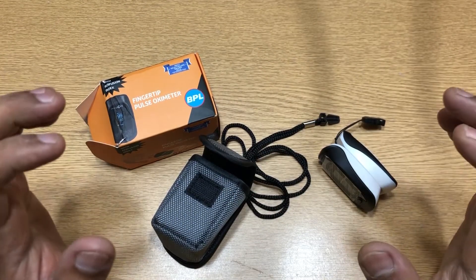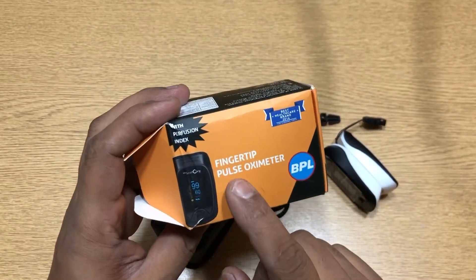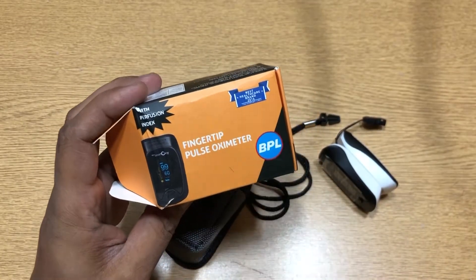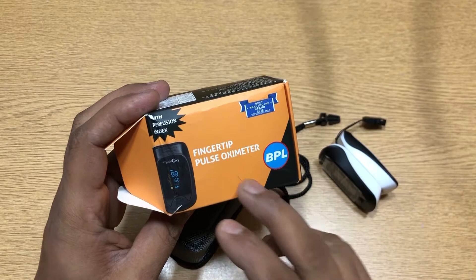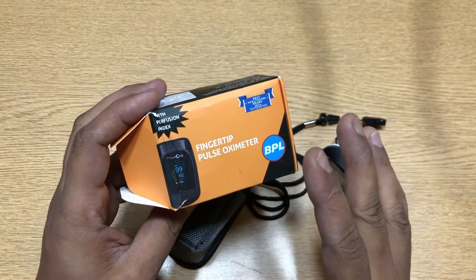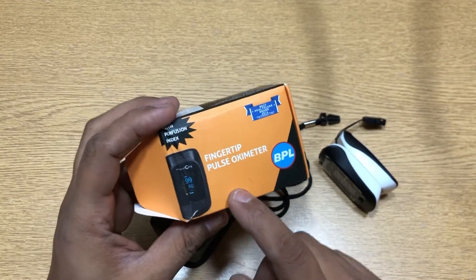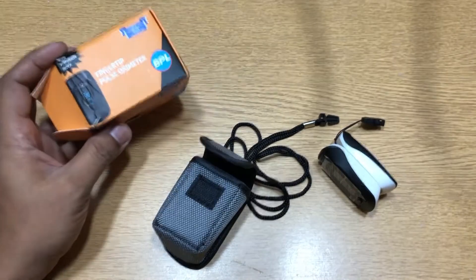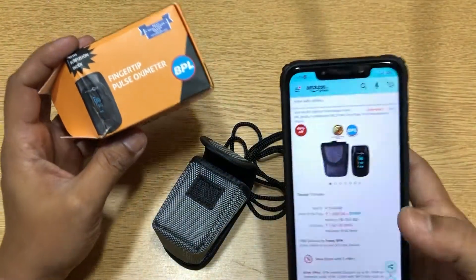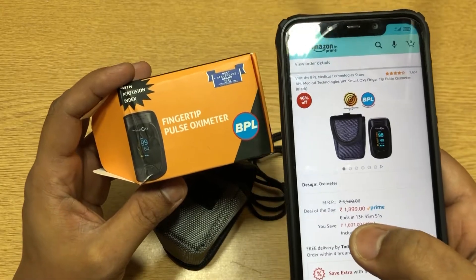Hi guys, back again with another video. This video is going to be a real-life review of the BPL fingertip pulse oximeter. I've been using this particular model for the past almost six months. This was purchased when it was a little expensive — I bought it for around two thousand nine hundred, and right now it's available for one thousand eight hundred ninety-nine, so it's pretty cheap.